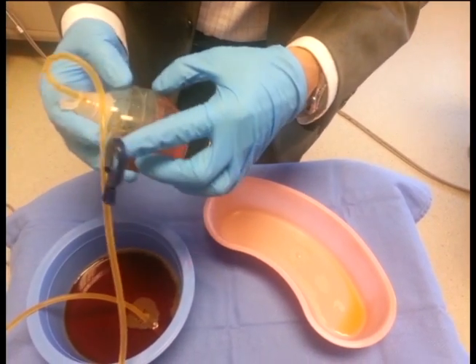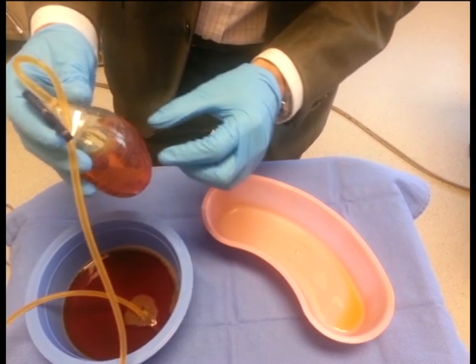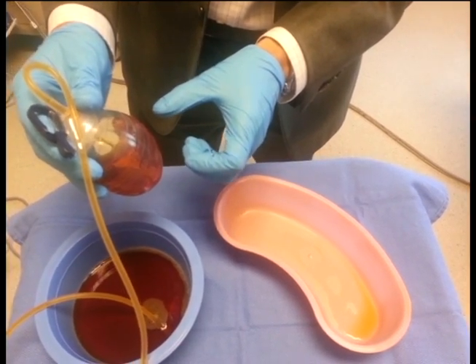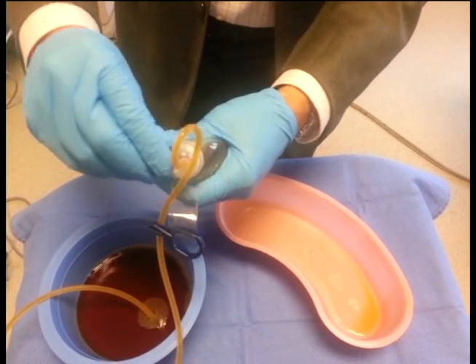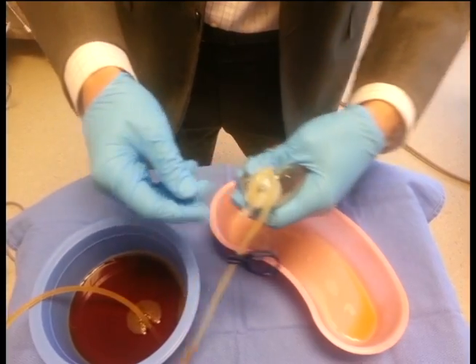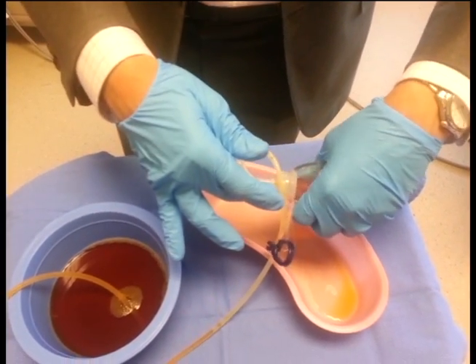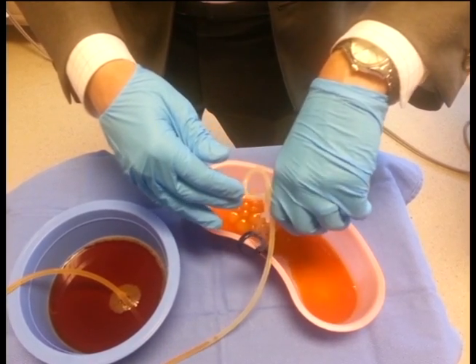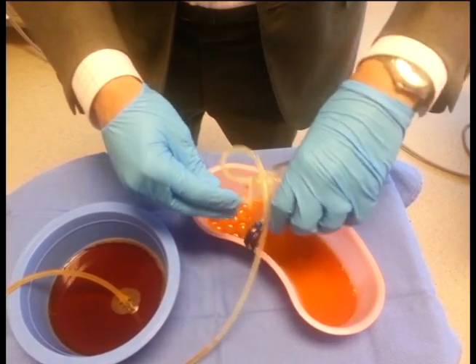When the reservoir is about one-half to three-quarters of the way filled — which would be about 50 to 75 cc's — that's a good time to empty the drain. You can remove the cap from the drain and empty the fluid that's inside.